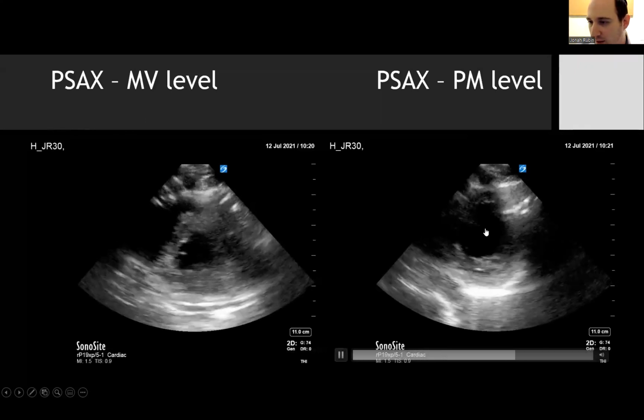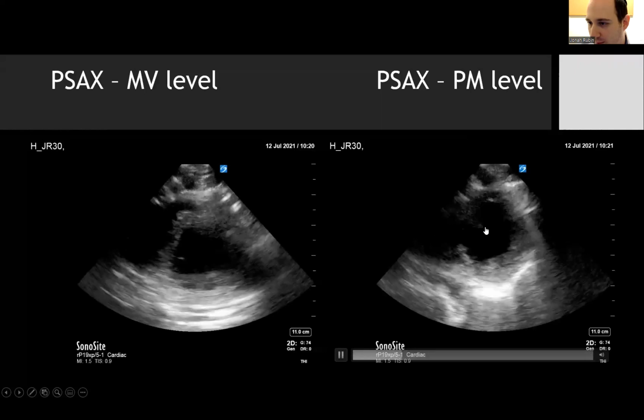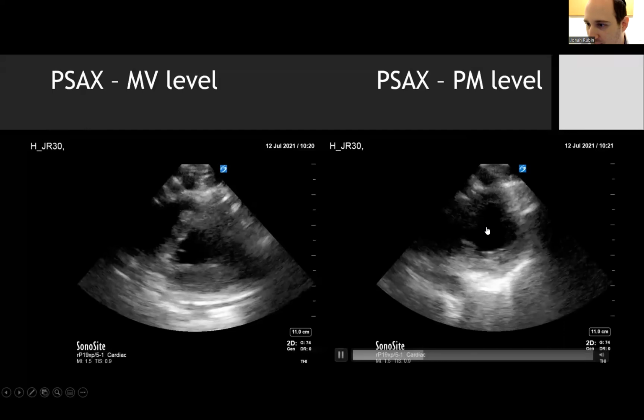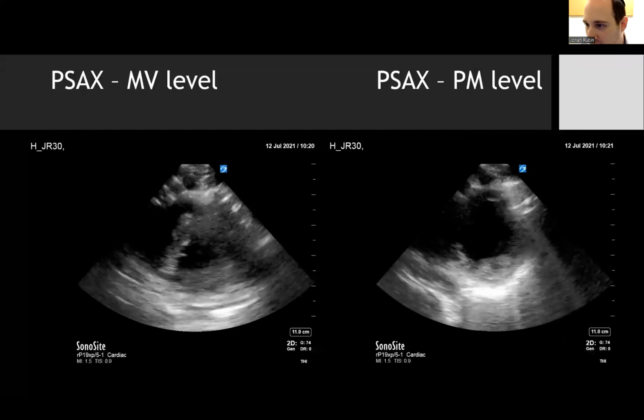And here, again, I appreciate that you're looking for wall motion abnormalities. If you put your finger, like I'm putting the mouse right in the center, is it biting in at all sides equally as best you could tell?